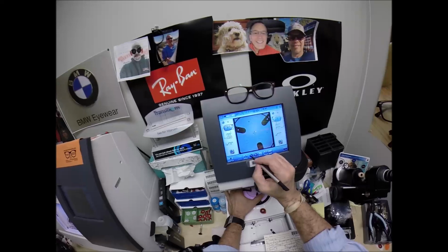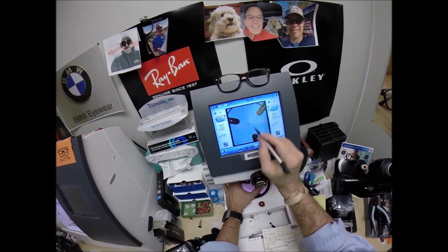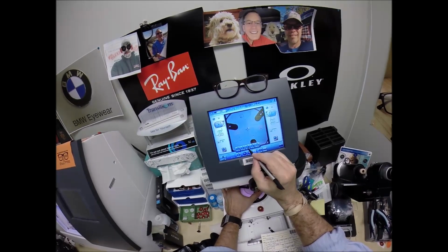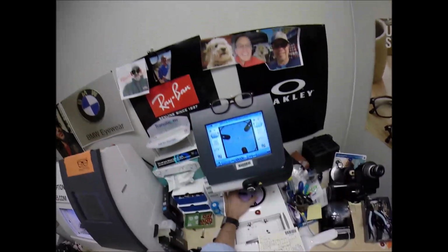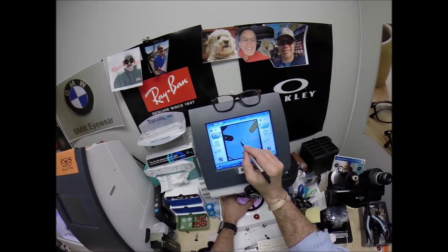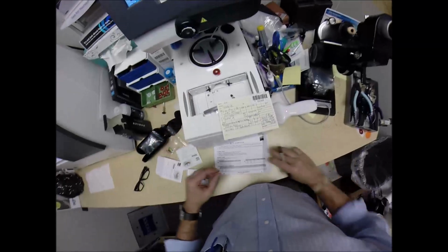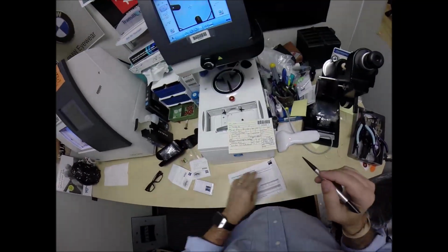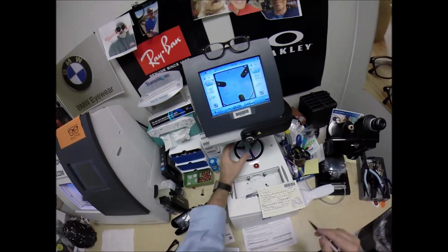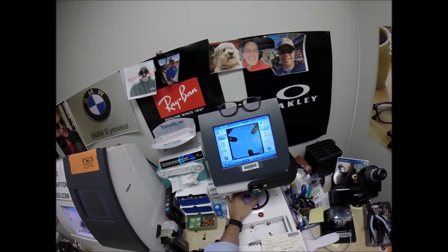And I need to change the layout screen from single vision to progressive. You can see the orange graph there. If these were line style bifocals, this would be the layout. But we're going to go back to progressives. The blue cross is the geometric center of your frame. Your eye is just above that in inset. How much is it inset? 2.5 millimeters. You gotta love that. Zeiss is German high performance engineering at its finest.